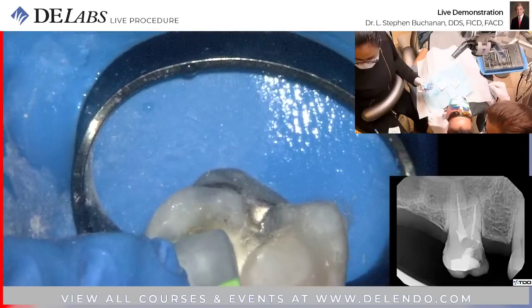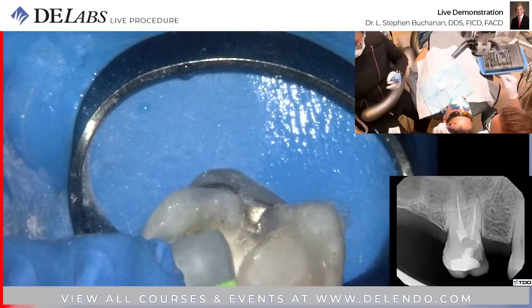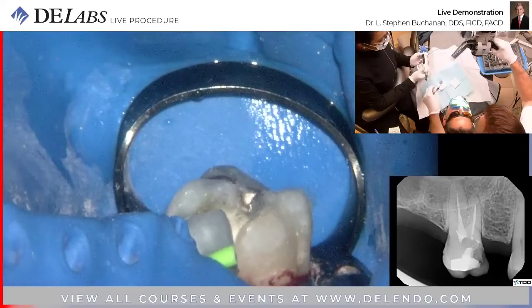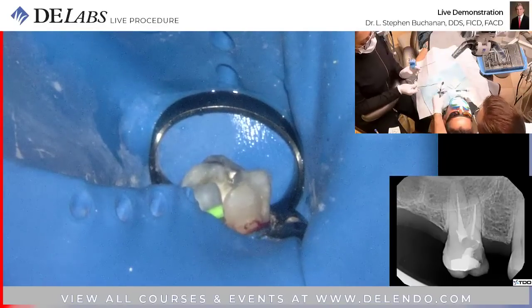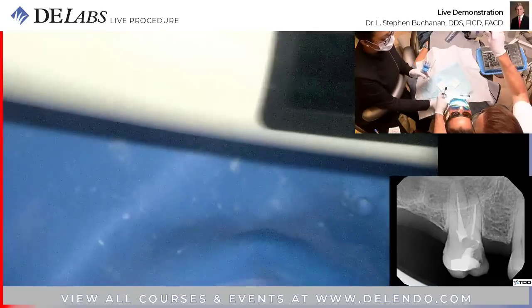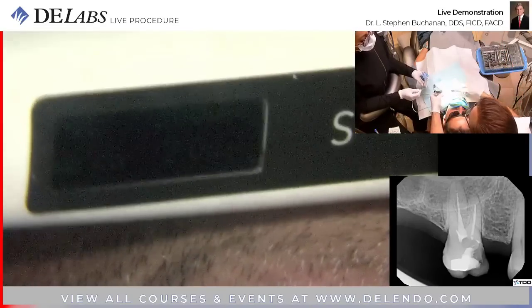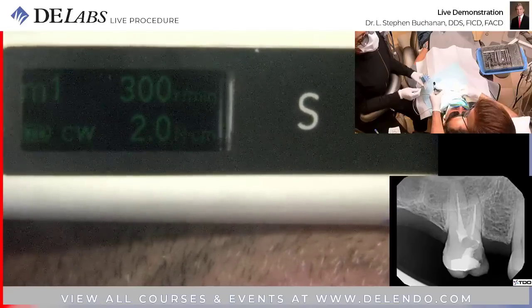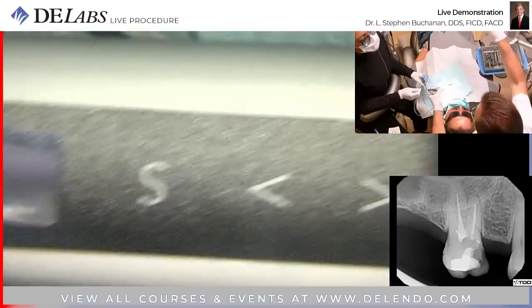Okay, let's use the Merita handpiece. So we're going to do a torque limit of 2 Newton centimeters. This is the M1, what you had scheduled as a first position, 300 RPM, 2 Newton centimeters.